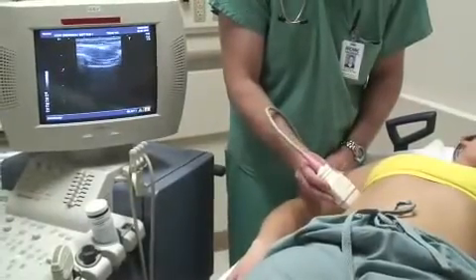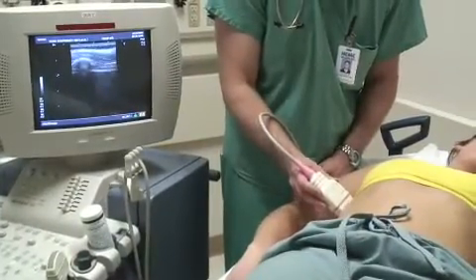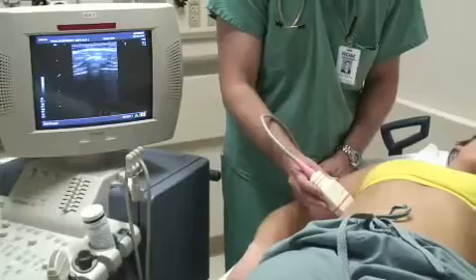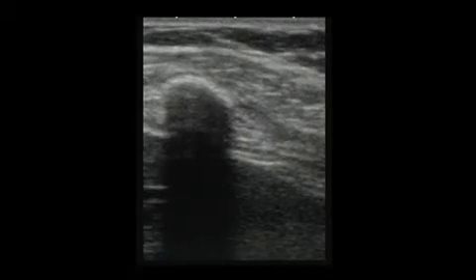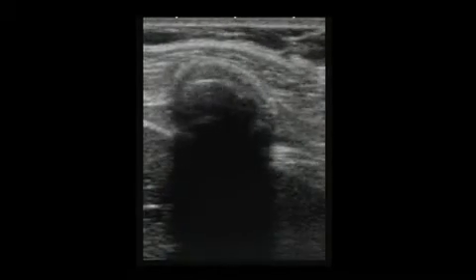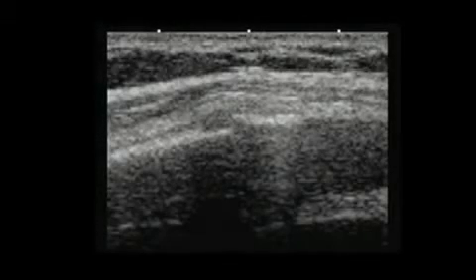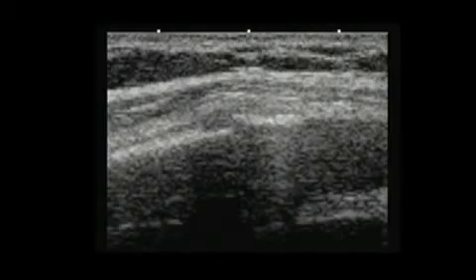With a little bit of practice, the ribs can be followed quite quickly, with the area of fracture jumping out and appearing obviously different from the normally smooth cortex of normal rib. Remember: trace the rib through the area of maximal tenderness using a transverse view until a change in the cortex or overlying hematoma is identified. Then rotate the probe 90 degrees to obtain a longitudinal view of the rib and confirm the diagnosis.